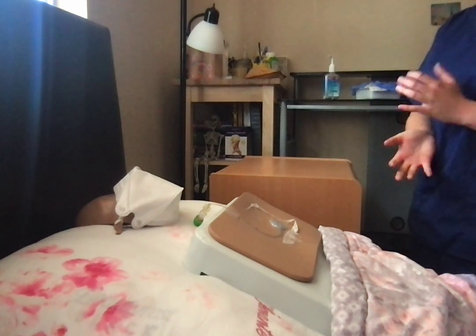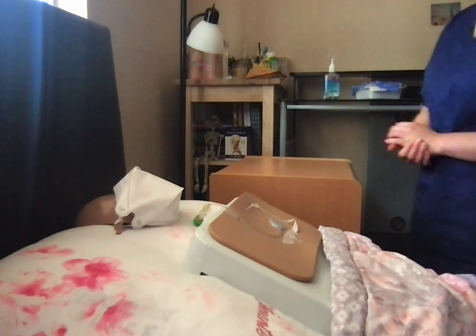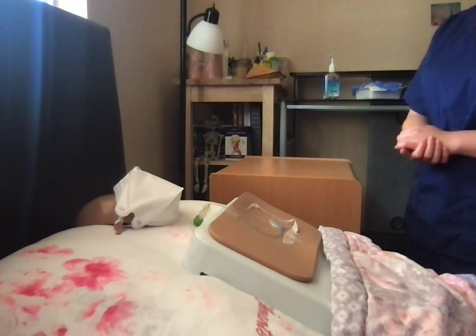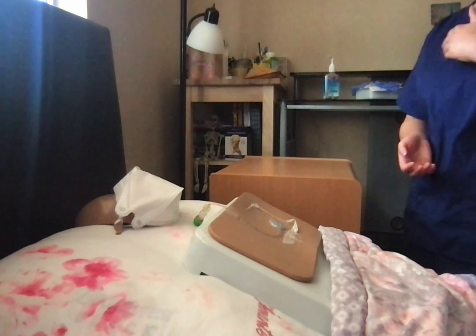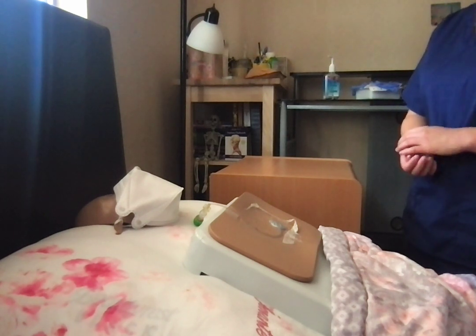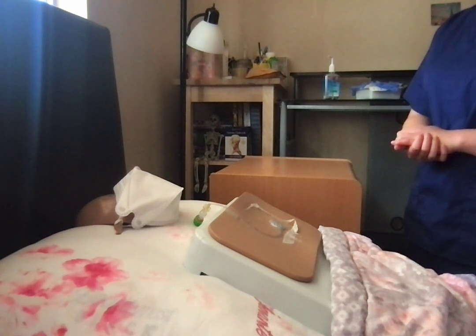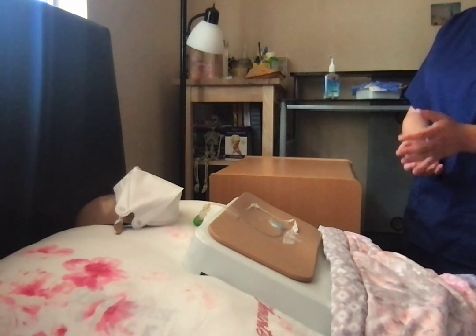And are you allergic to anything, including latex or chlorhexidine? No allergies? Perfect. So today I'll be changing your central venous access device dressing, or CVAD dressing for short. Your CVAD is the tubing that is on your left chest and there's a dressing on top of that. This dressing needs to be changed every seven days. It's been seven days since your last change, so I'll be changing it for you today.